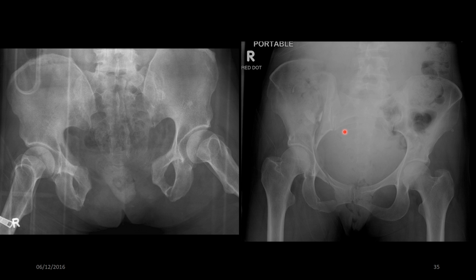And we just need to remember with portable examinations, it's X-rays that we do portably, and we have to make consideration of IR(ME)R and radiation protection, and how it will change the management of the patient. And now we're going to move on to theatre radiography.